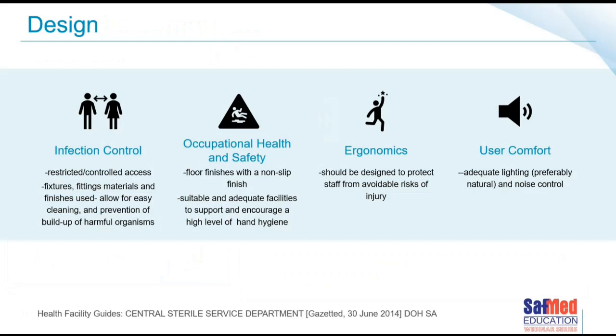These gazetted documents go ahead to describe the fact that when you're designing your CSSD, and of course other facilities, but specifically focusing on CSSD, you need to take into effect a number of things, not just flow. You need to take into account infection control, occupational health and safety measures. You need to think about ergonomics, and you actually have to take into account user comfort. Who knew that they actually do take that into account? But funny enough, they do, and very important aspects.